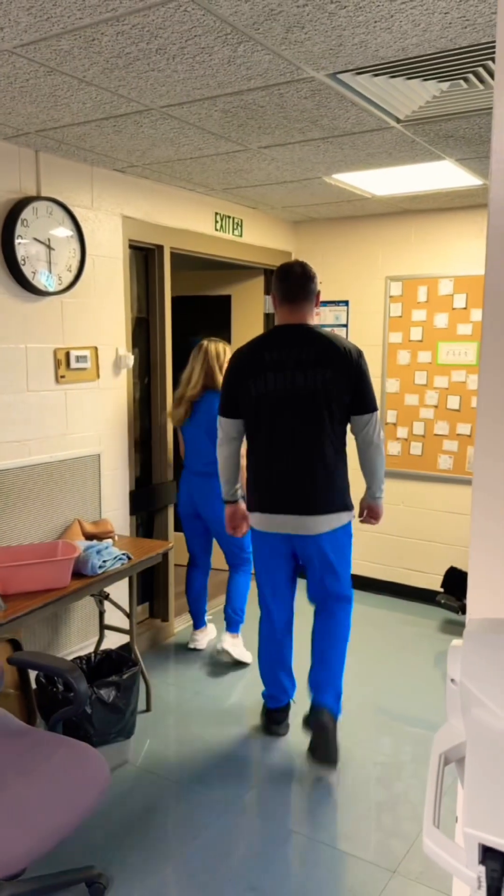All right, thank you. We're done with your exam. I'll walk you back out to the waiting room. Thank you. Have a good day.